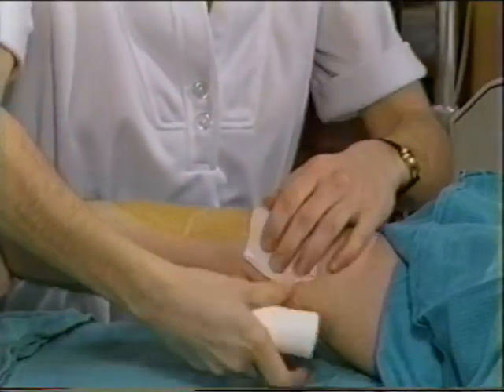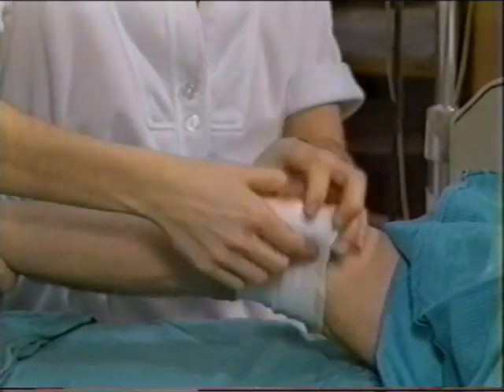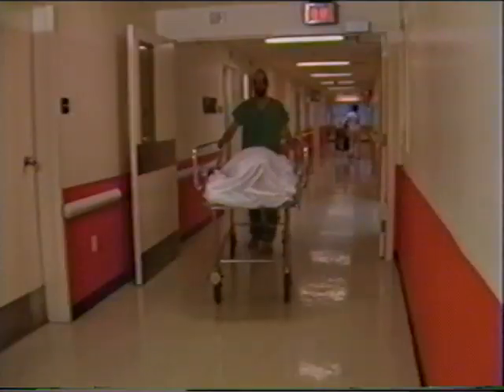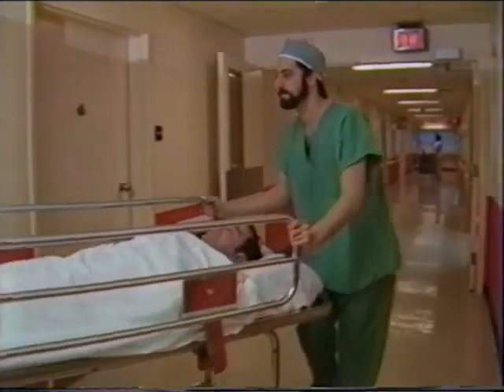Once your cardiologist has taken all of the X-rays required, the catheter will be removed. If an incision was made, a few stitches will be used to close the skin. The area will be bandaged. The procedure itself usually takes 1 to 4 hours, depending on how involved the procedure is.